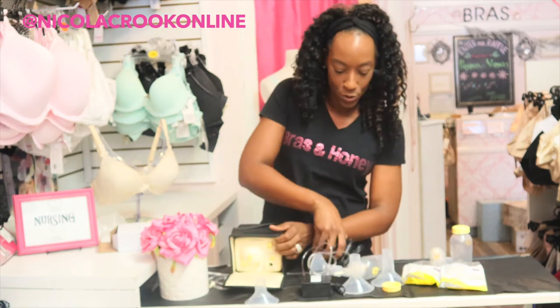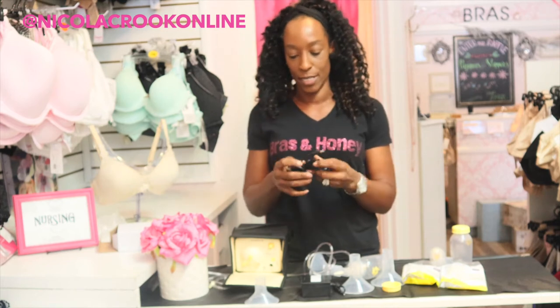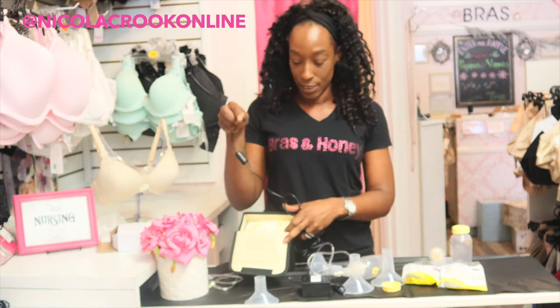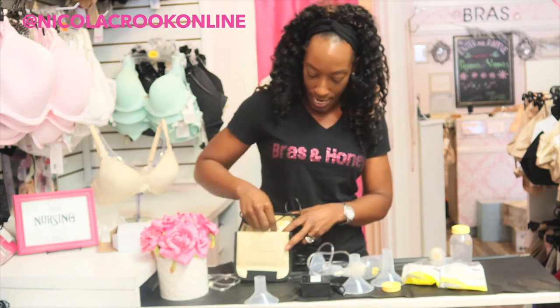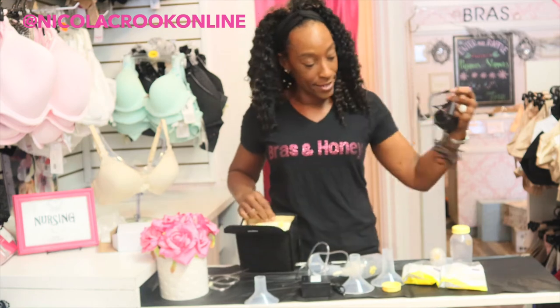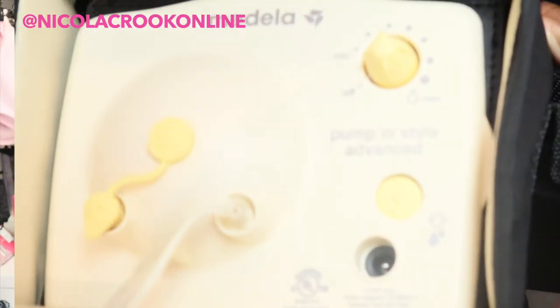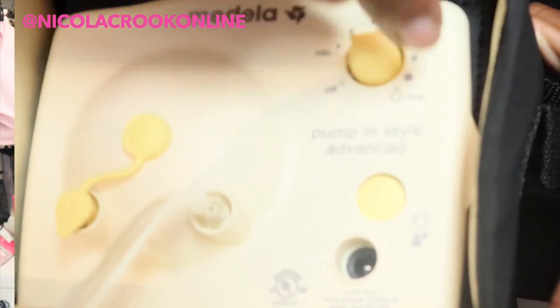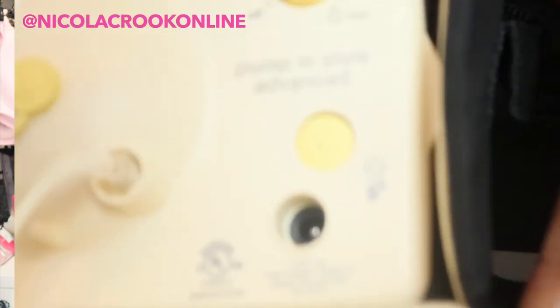Plugging in is really simple and easy — you just put this little connection in here like so, plug it into your wall, and then you have your little power switch here so you can decide on what's most comfortable for you with regards to the suction.